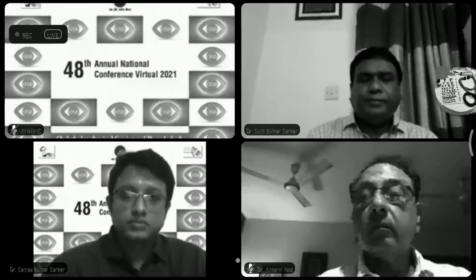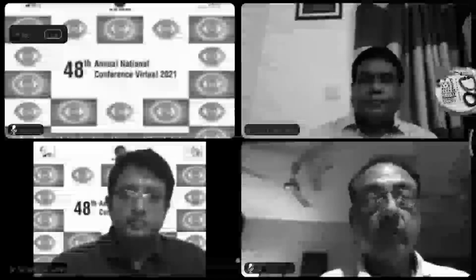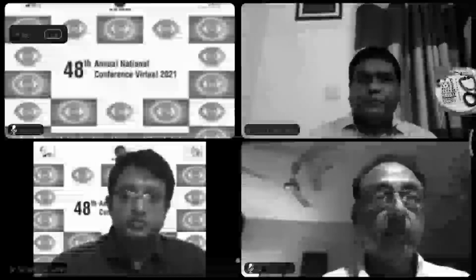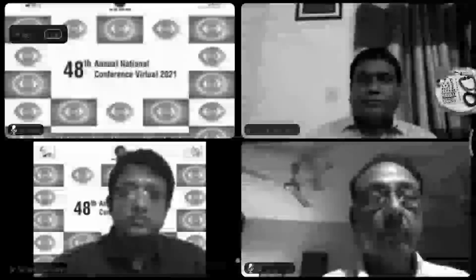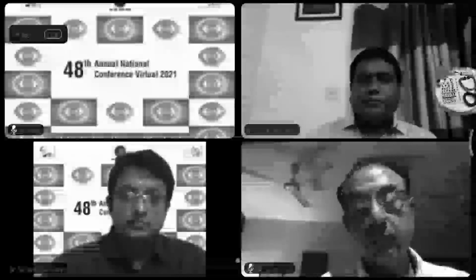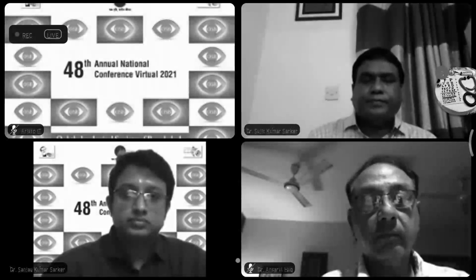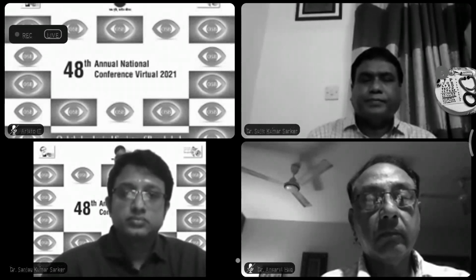Dr. Aminul already mentioned its use in fluorescein angiogram. One question arose from our respected Professor Moshahid Thakur sir: what is pseudofluorescence, what is autofluorescence, what is retrofluorescence. I think it is very, very important. Pseudofluorescence usually we don't see nowadays because it's the mismatch of our filter, and nowadays the instrument is so well equipped that mismatch usually does not occur, but it can occur sometimes.